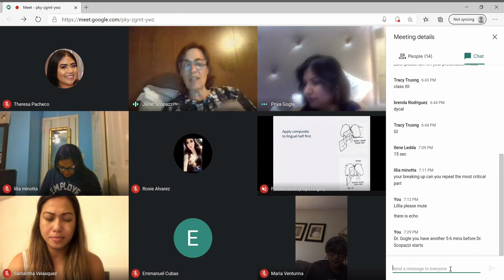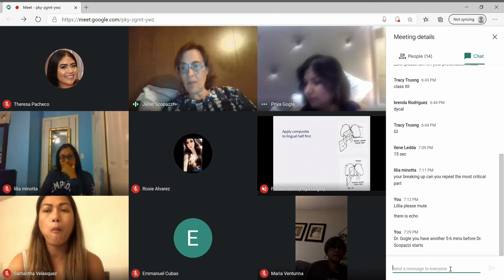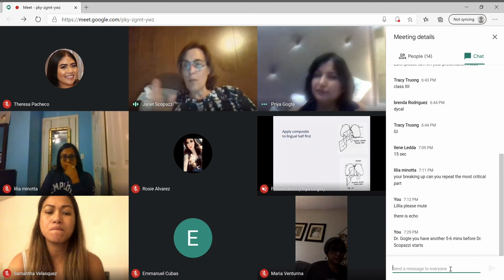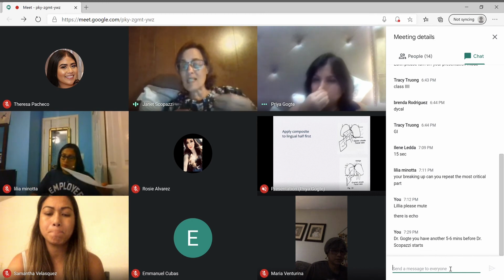So definitely, if you have any questions about a shade, take some of the composite. Do not etch the tooth, do not do anything. Put the composite on the tooth and light cure it. It will not stick, right?